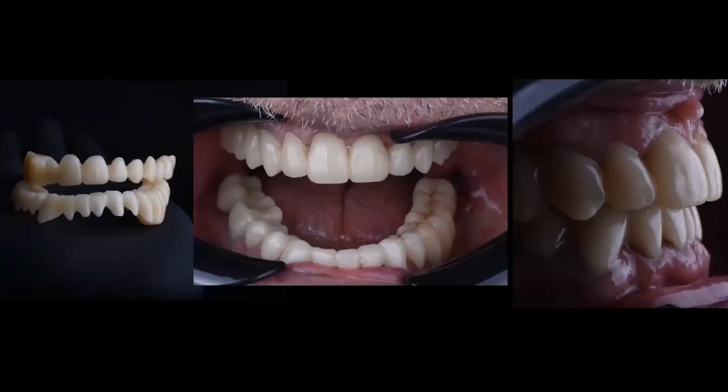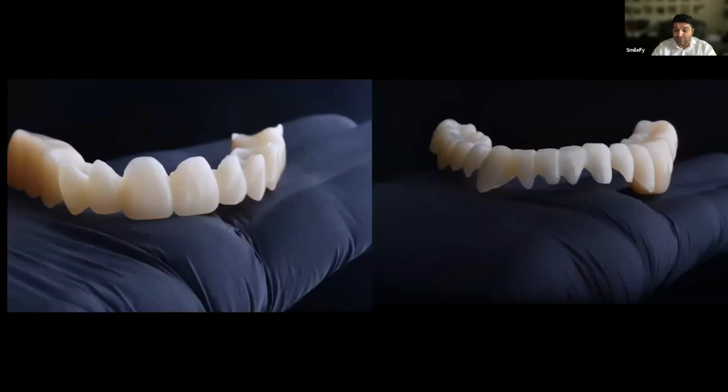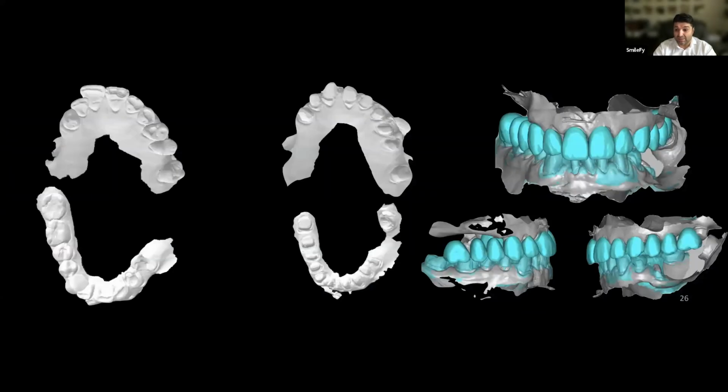How do we adapt the gingival base to the bony cut maxilla before printing? In what case? In this case, or in general? We don't adapt the gingival base to the bone cut maxilla before printing. We can cut the bone digitally. Exactly. Digitally, or otherwise you design facially driven.